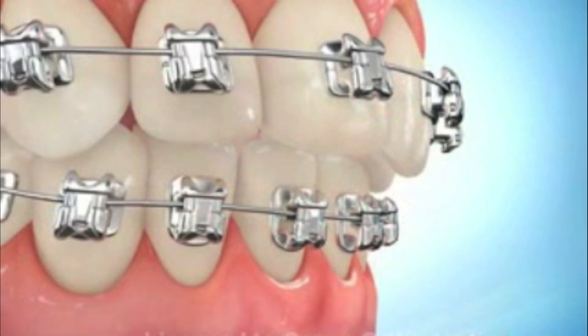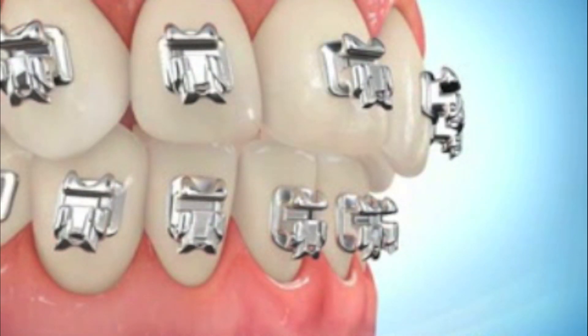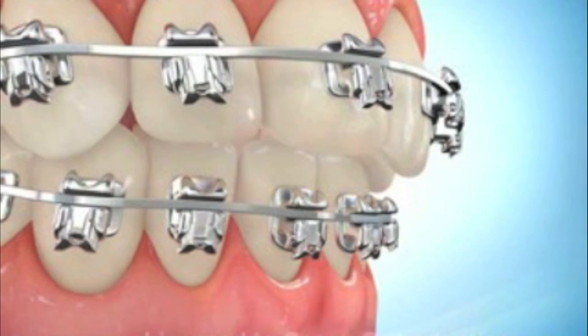The next stage is what orthodontists call mechanics, and what that really is talking about is fixing bite problems. That's traditionally done with fairly strong wires — sometimes steel, sometimes titanium, molybdenum alloy, and others. It's also the phase where most commonly you're using rubber bands or elastics to pull the teeth this way or that.